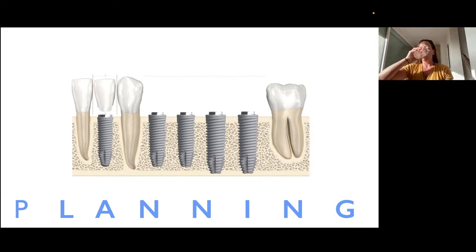So what kind of planning do we have to have in mind in order to check if we have the available bone to place these implants?